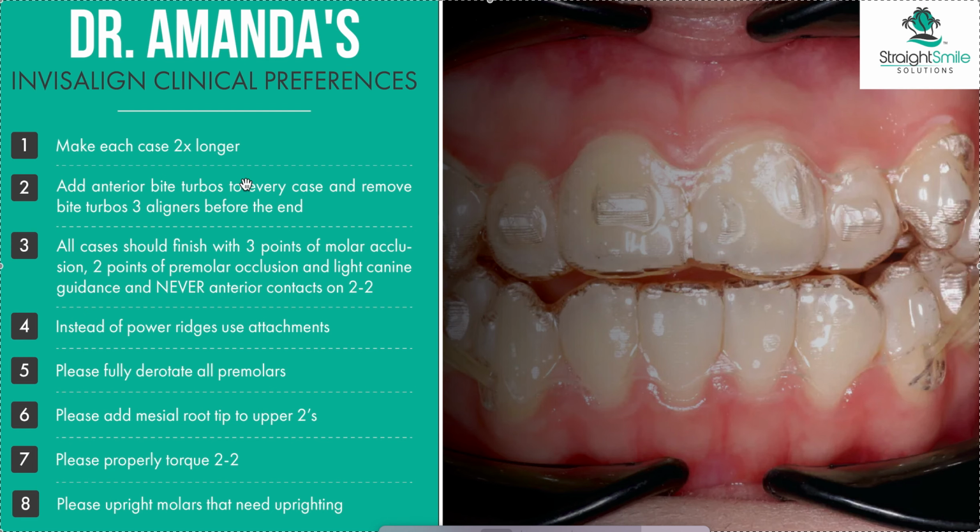But if there is an implant or a major filling or a root canal, I'm going to take it off that tooth specifically. So you have to manually do this. You can't tell them to do that. You have to go in and do that. You have to think about these things on every single case.